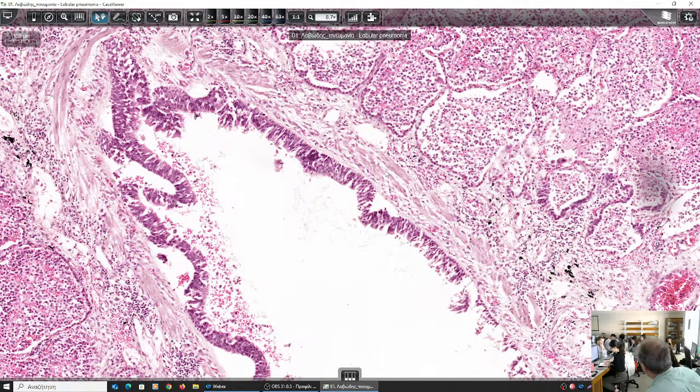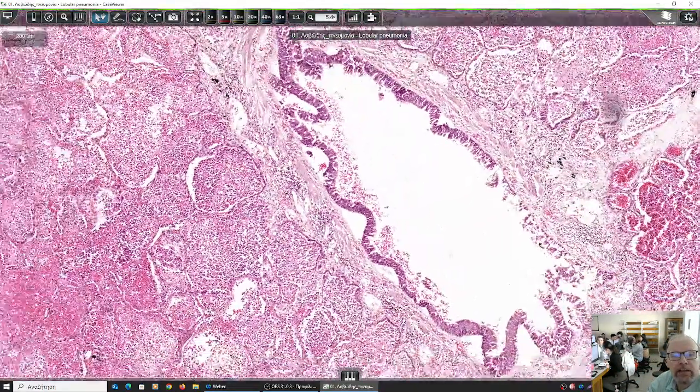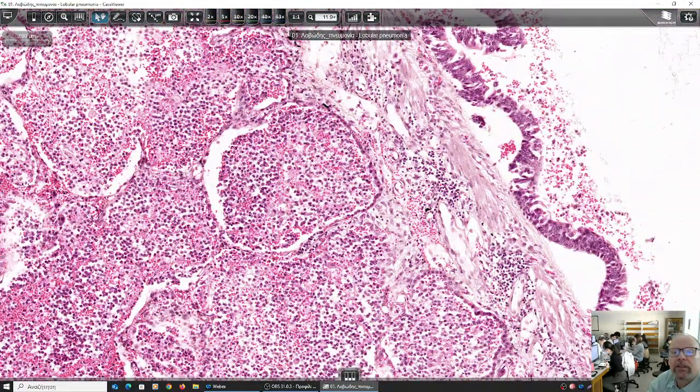Is it affected by inflammation? Do we see inflammatory cells in relation with the bronchus? No. It's relatively clear. Where is the inflammation? The inflammation is nearby. Where? What are these structures here being filled with the inflammatory exudate? What would these structures contain under normal circumstances? Because here we have pathology, a disease, these structures are filled with inflammatory exudate instead of air. So these are the alveoli.